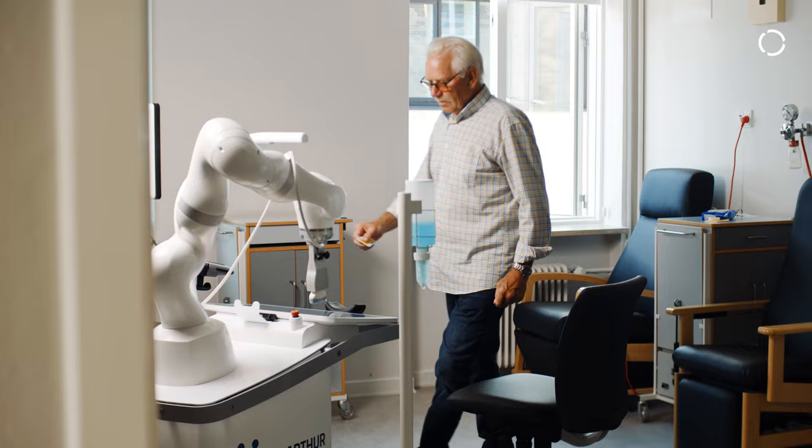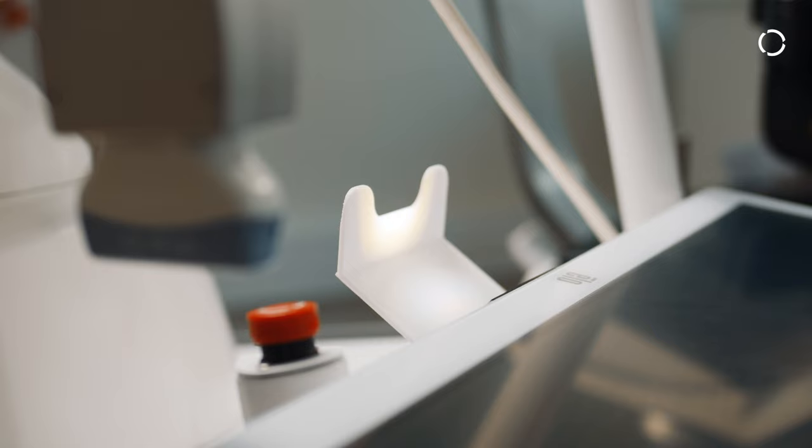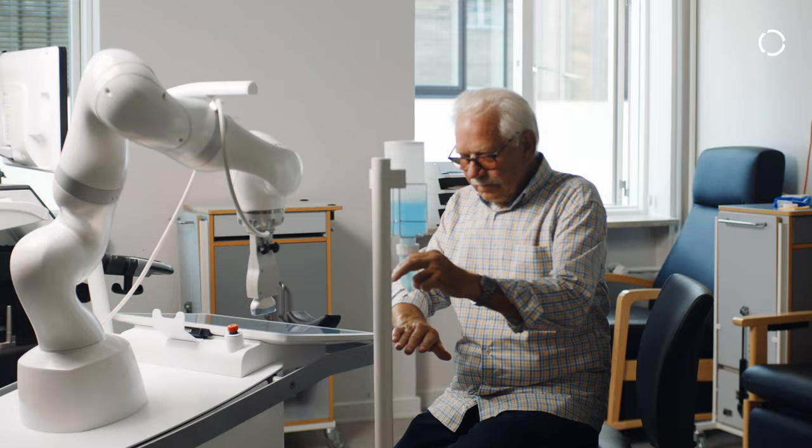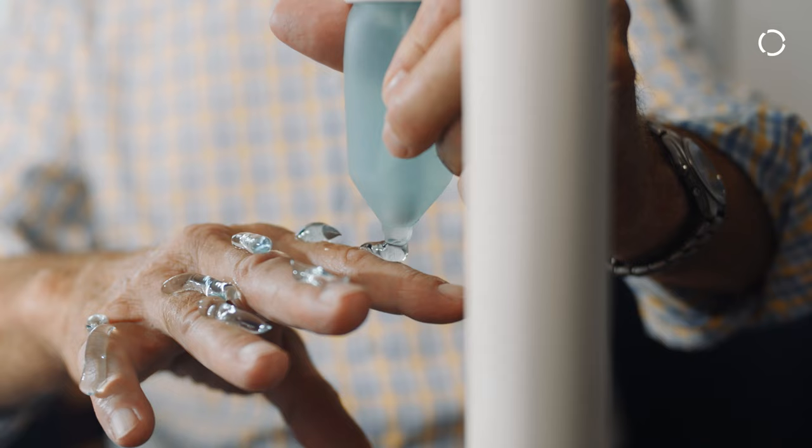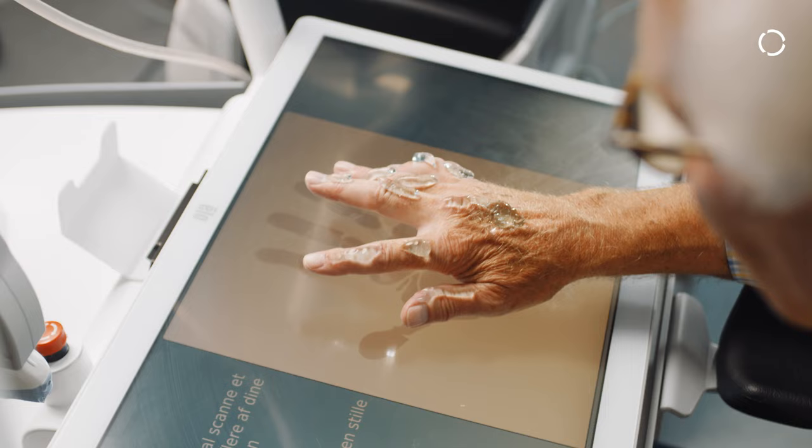The process of being scanned by Arthur, the fully-automatic scanning robot, is as follows. Patients identify themselves with a unique ID. First, they're asked to remove jewelry and are told how to apply ultrasound gel on the joints. Then they place their hand on Arthur's touch screen.